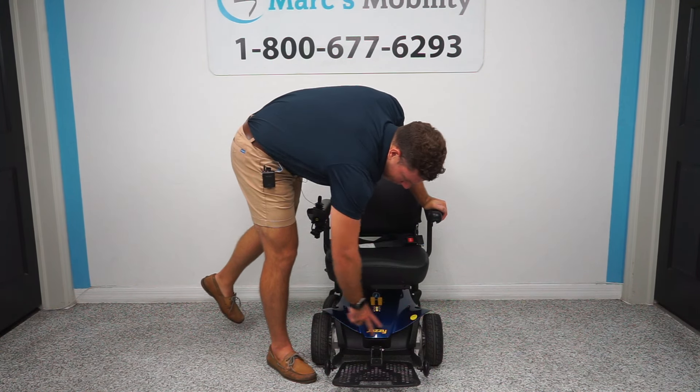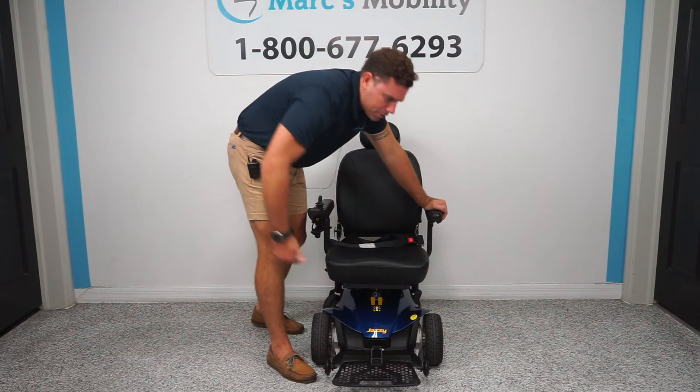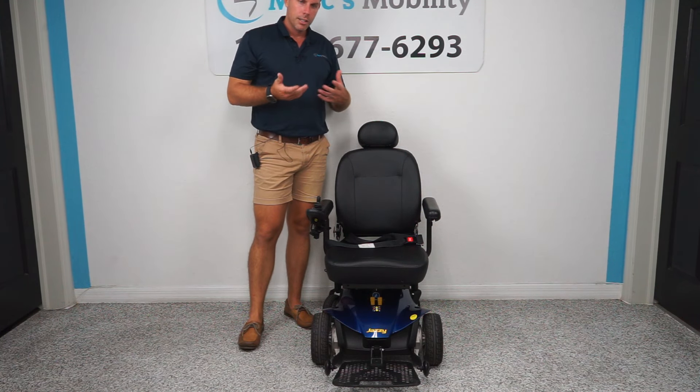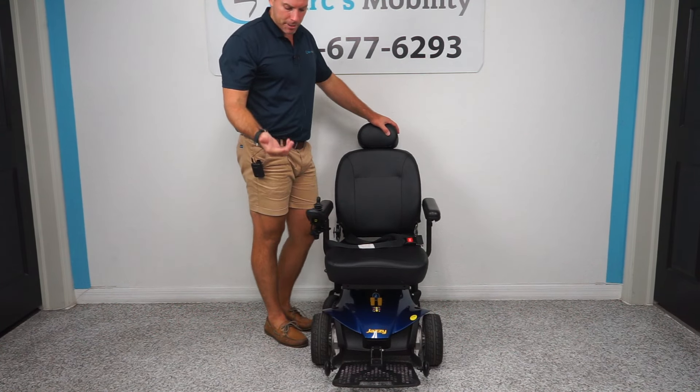There are two levers here because the motors are underneath this shroud. If you ever need to put it in freewheel, push those levers towards the seat post to disengage the motors and push the unit around. You always want to make sure they're in the engaged position so that you can drive the unit.